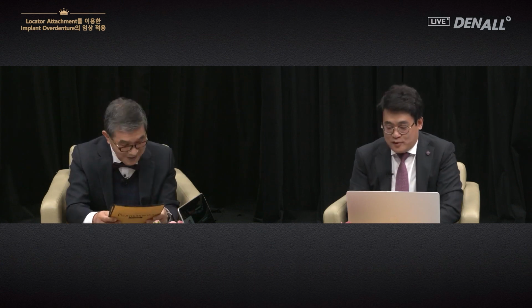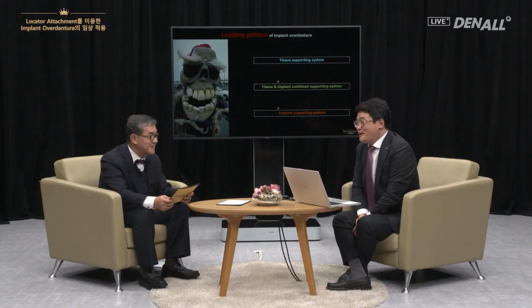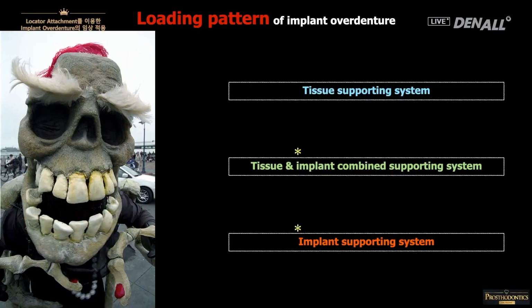The ISO, the International Organization for Standardization, recommends that the term fixture should be replaced in the future with implant. If you really want to emphasize the fixture, you should say implant body. Therefore, at Ostom, we decided not to use the term fixture. Okay, I will change. I've changed.